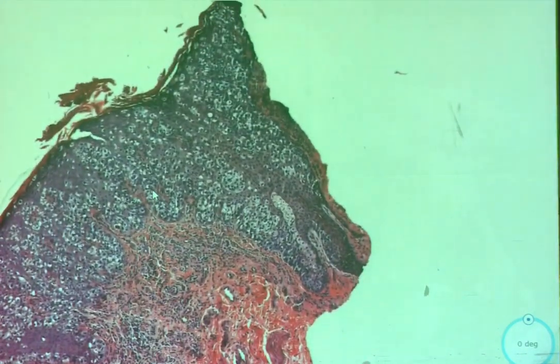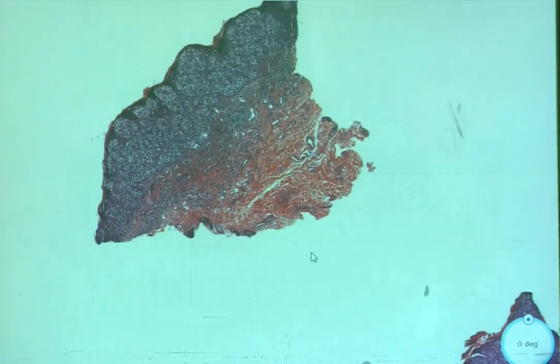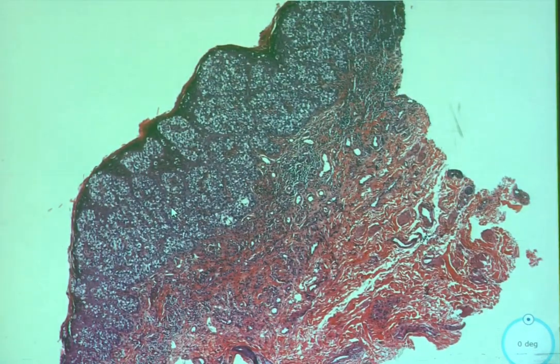This is super obvious because I try to be nice during these sessions and give you good examples, even if they're hard. So, this is a little bit of an aside for anyone who isn't party to our lectures during the day. Earlier today I was talking about Toker cells in normal breast. Toker cells also are clear, but they'll only be in the basilar layer. So that's why Toker cell hyperplasia has to be differentiated from Paget's. It looks exactly the same, but for anyone wondering what she's talking about, there is something about Toker cells in your handout.